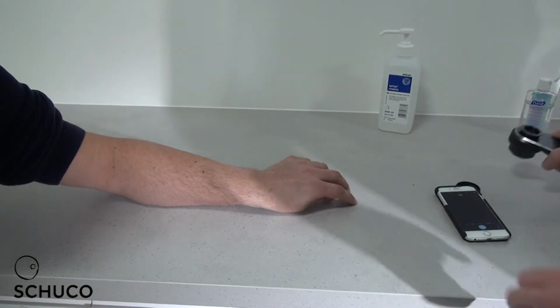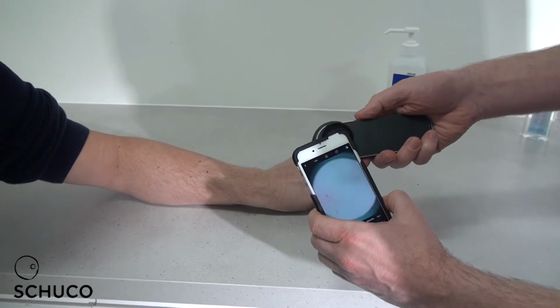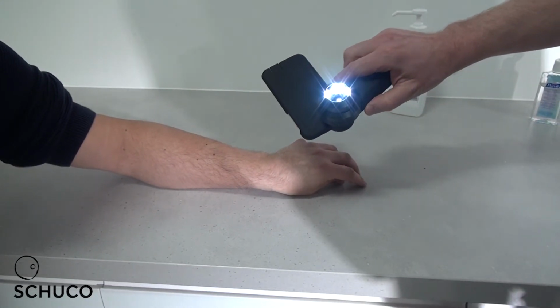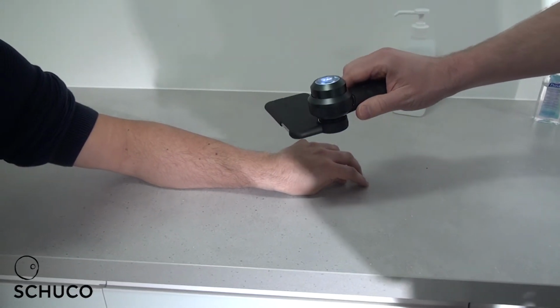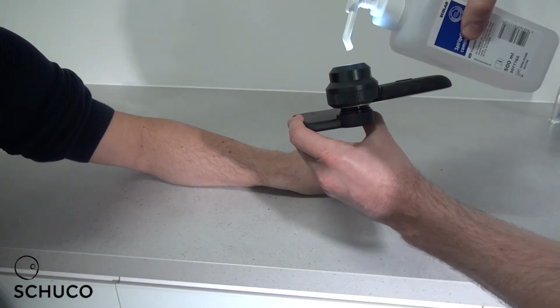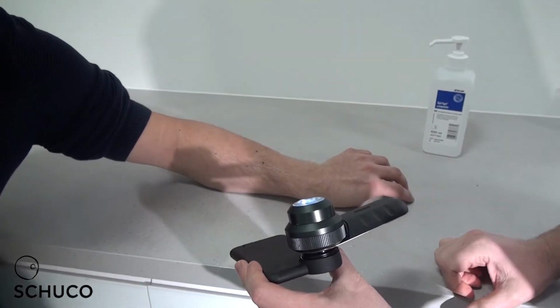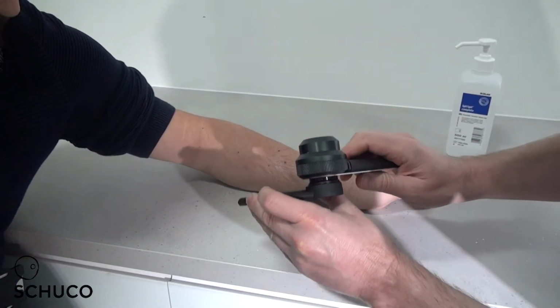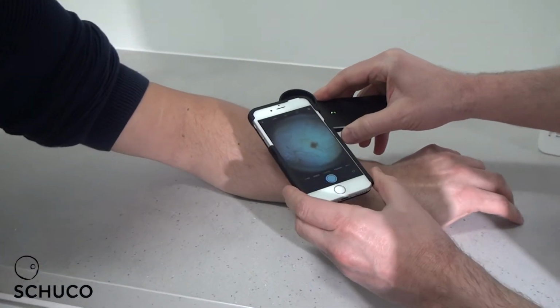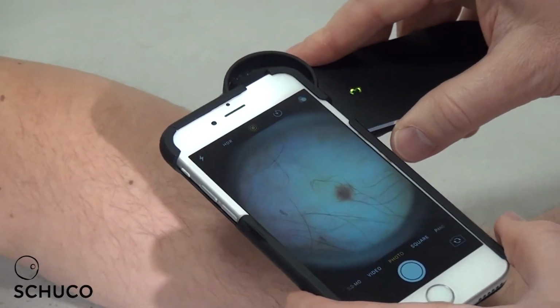To take an image for teledermatology, connect the dermatoscope, turn the dermatoscope on, pressing the button. Just gently touch the right-hand button again to make sure it is in the non-polarizing setting. Apply a small blob of alcohol gel and then select the lesion you want to take an image of. So we're going to use this mole here. Gently rotate the dermatoscope onto the lesion to try and reduce the amount of air bubbles in the gel, because that will improve the image.